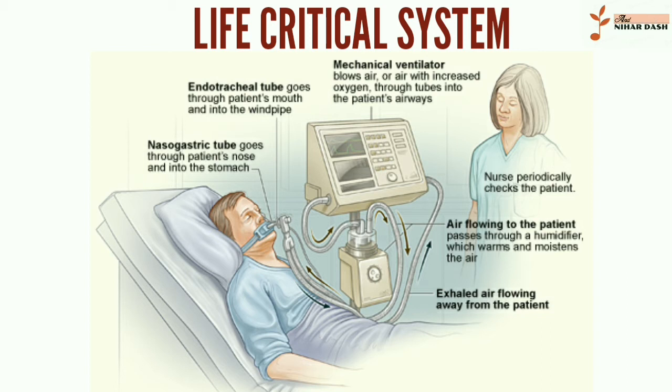Power failures, such as during a natural disaster, can create a life-threatening emergency for people using ventilators in a home care setting. Battery power may be sufficient for a brief loss of electricity, but longer power outages may require going to a hospital.